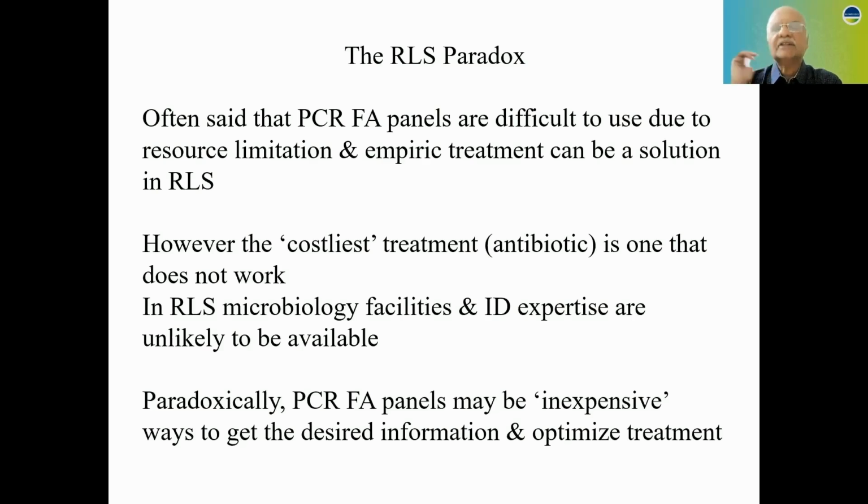And that brings me to what is sometimes called a RLS, or a resource limited setting paradox. It's often said that PCR film array panels are certainly difficult to use due to the cost and due to resource limitation. And in this situation, maybe empiric treatment can be a solution in resource limited settings. However, I will submit to you that the costliest treatment, mainly antibiotics, is one that does not work.